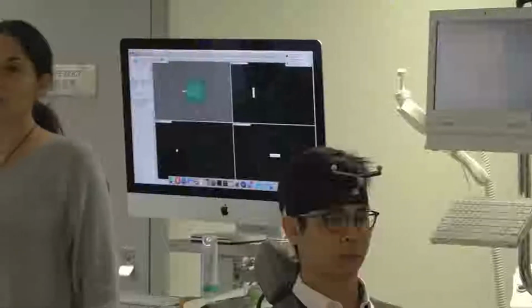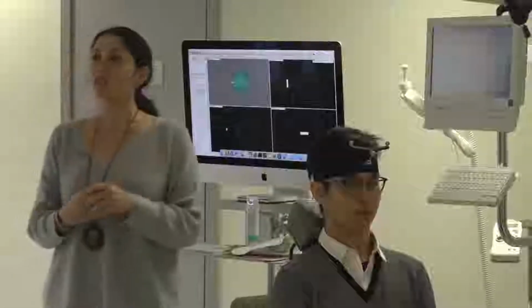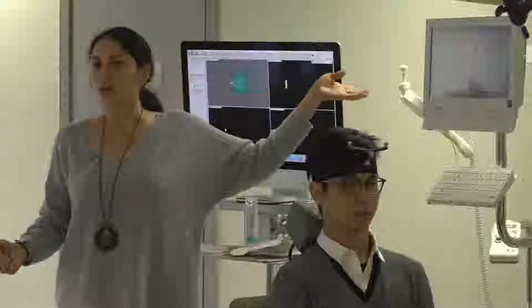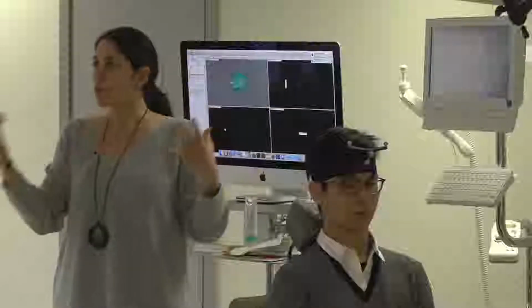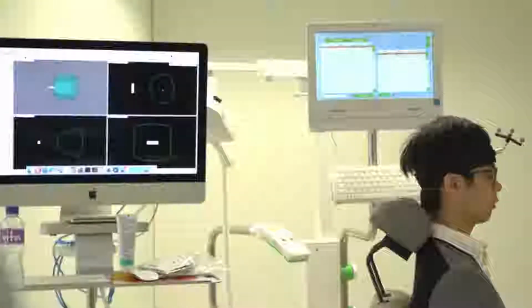So we have a coil that is normal, like it's smaller. I will use that one. When I'm going to do our TMS or very long protocols, I would use that one. Also, it's heavier, and I'm going to be holding the coil. Because it's more practical, and also easier, I will use this one.